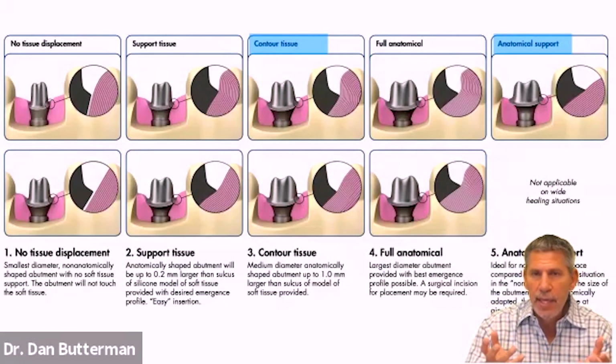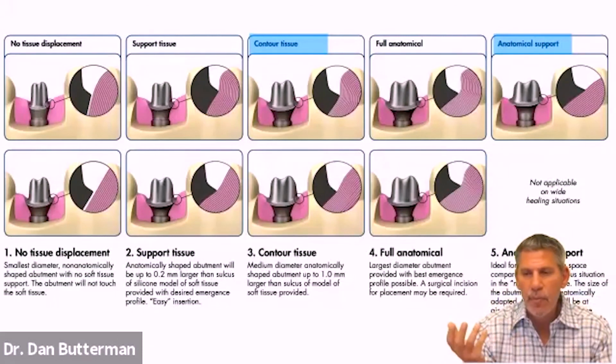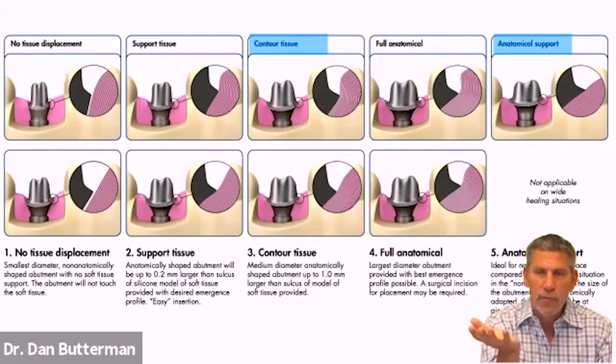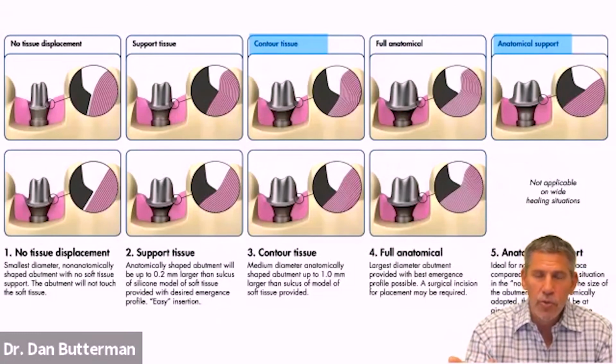The upside of that is that it's going to be easier. I'm going to have a fully supported ceramic with my abutment because it's full contour. The downside is that it raises that margin up basically equigingival. So I like them a lot in posterior areas that are not aesthetic, because you're more likely than not going to be able to see that margin just a little bit. But I would never use it for an anterior restoration.